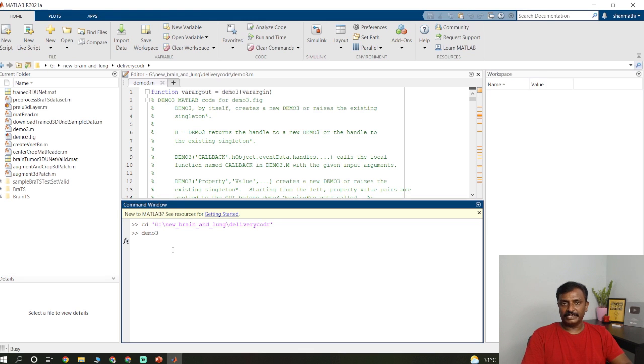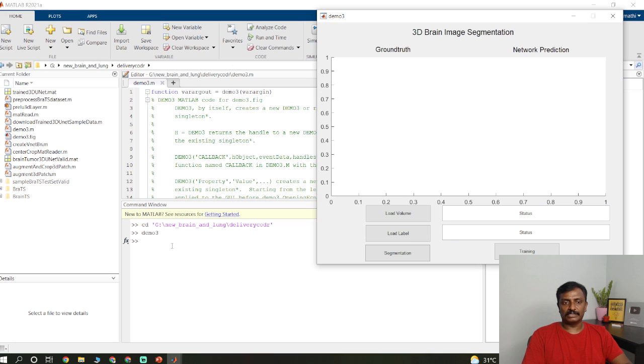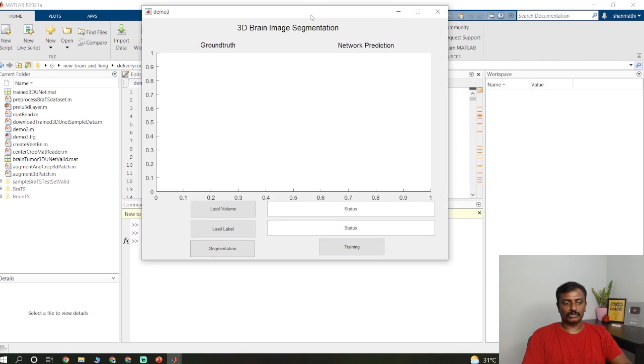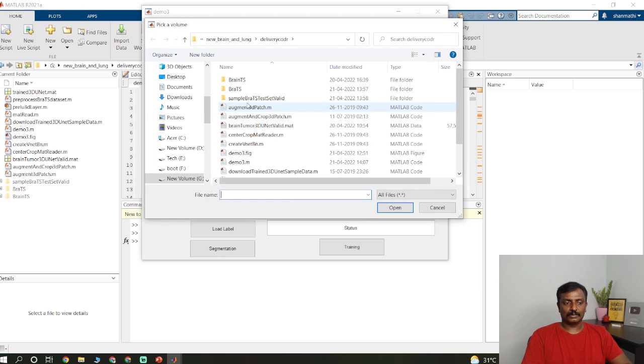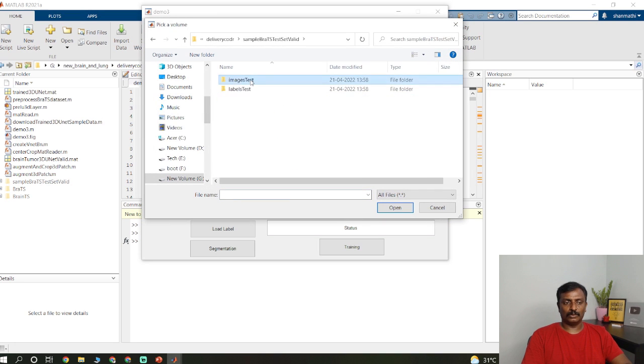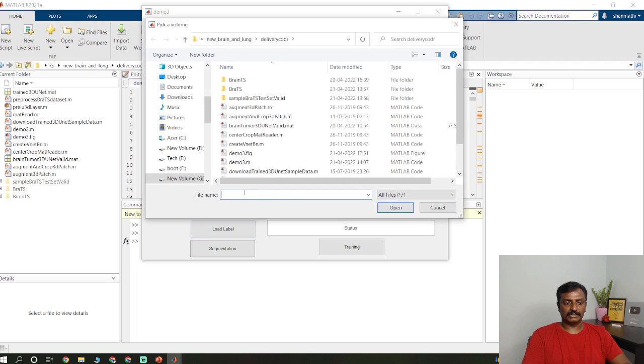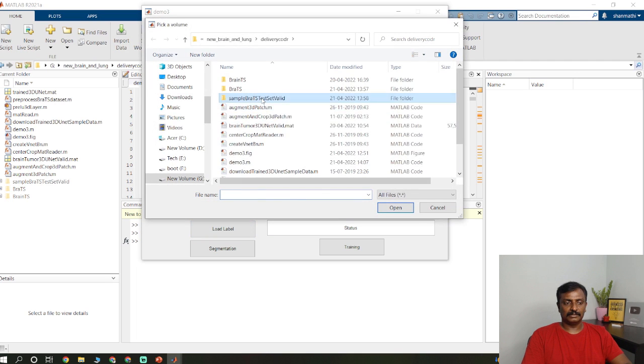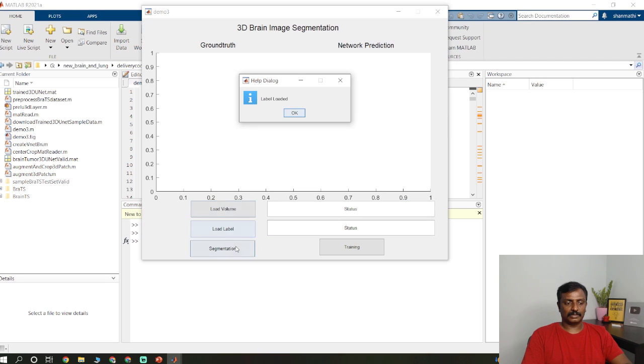So I have already developed the GUI, graphical user interface. You have to select the 3D images as well as the ground truth. Once you run this program, you will get the pop-up like this. Just load the volume. So I just load the test data sets and the label data sets.